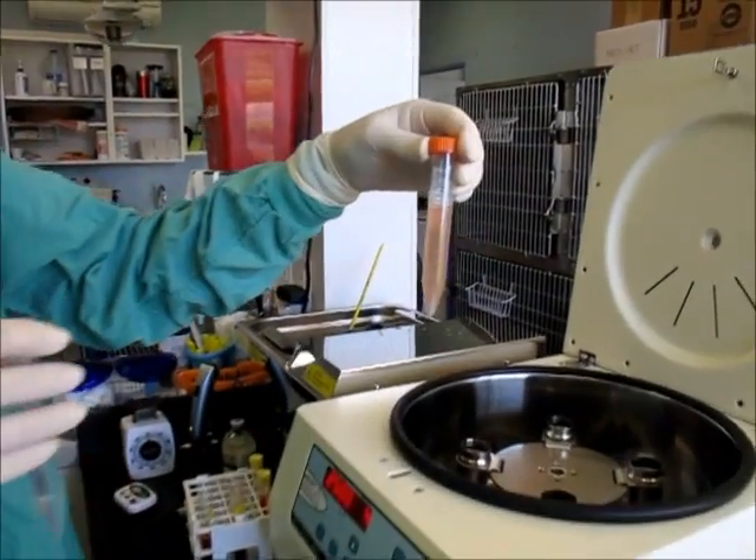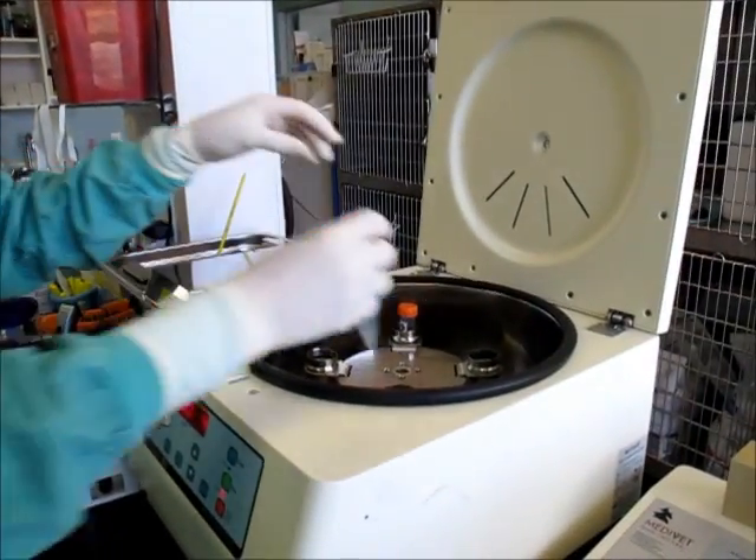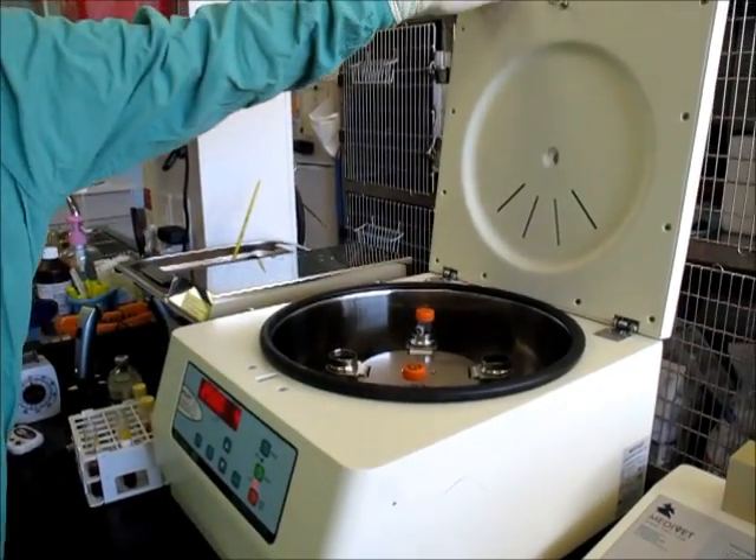Once we've combined all the plasma, we put it back into the centrifuge to spin out the cells.